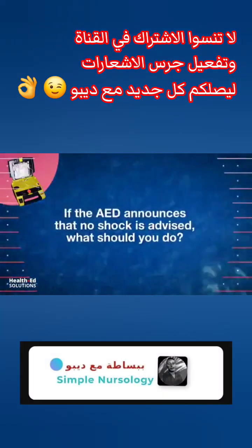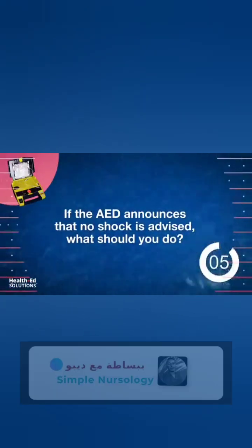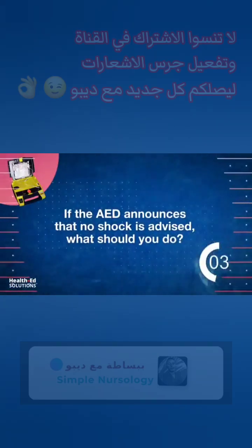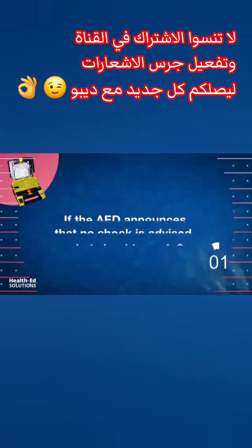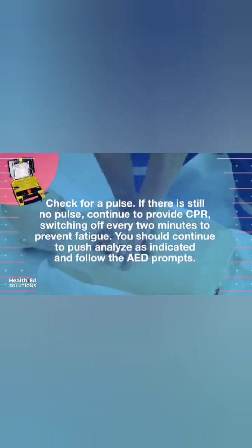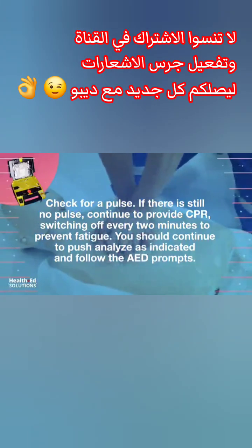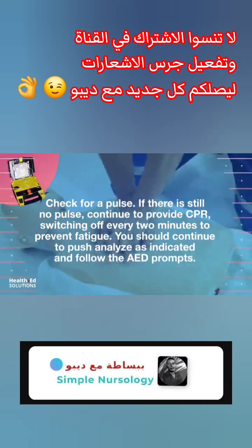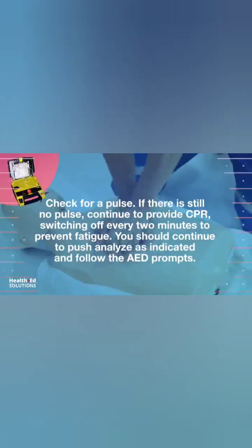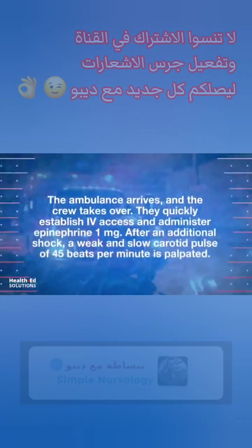If the AED announces that no shock is advised, what should you do? Check for a pulse. If there is still no pulse, continue to provide CPR, switching off every 2 minutes to prevent fatigue. You should continue to push Analyze as indicated and follow the AED prompts. The ambulance arrives and the crew takes over.